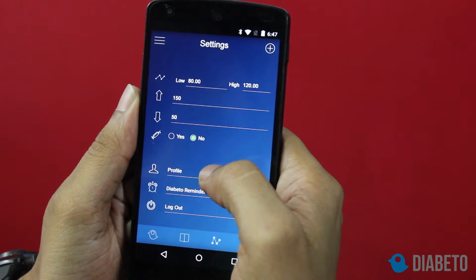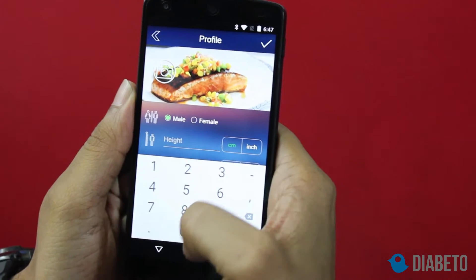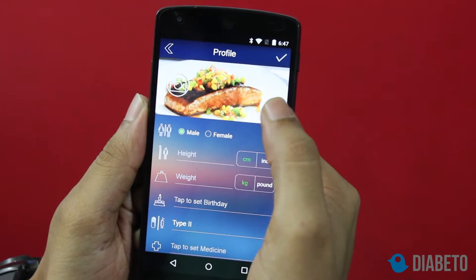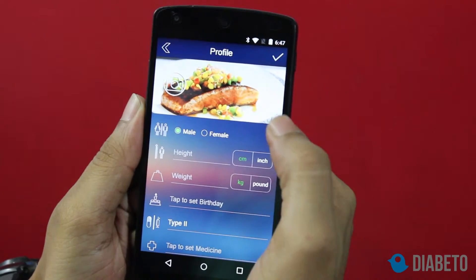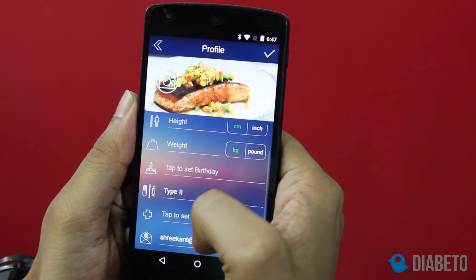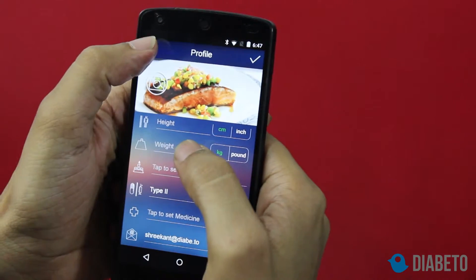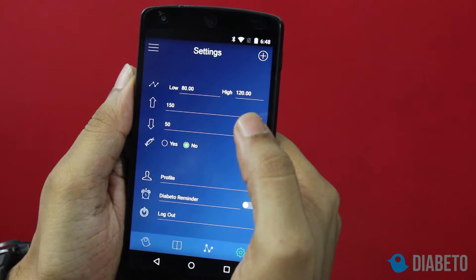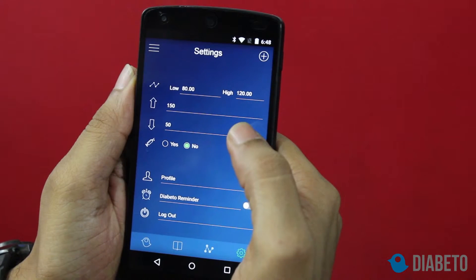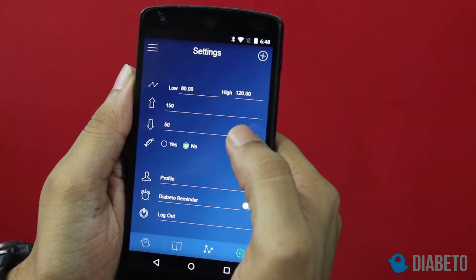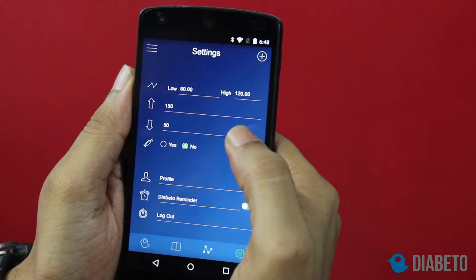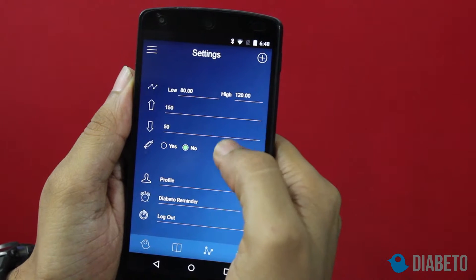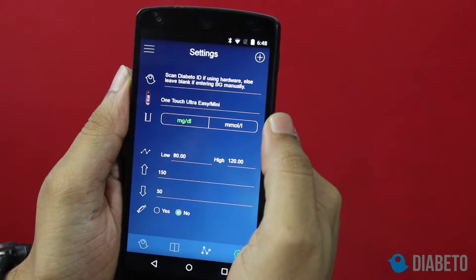The next field is the profile field — you simply have to enter all your details. You can even select your background image and fill in all those fields. The next field is the diabetes reminder, a feature where the application can remind you when to take the next blood glucose reading. Right now I have disabled it. That's it for the settings screen.